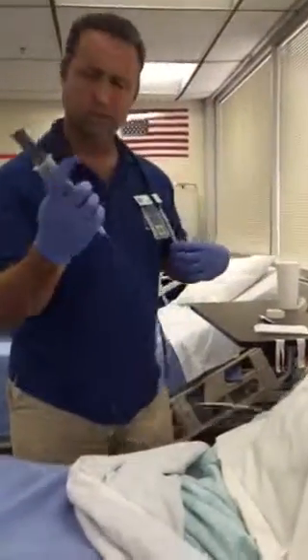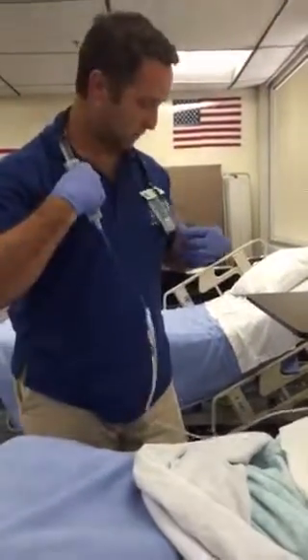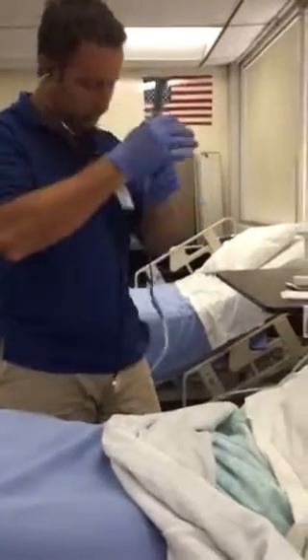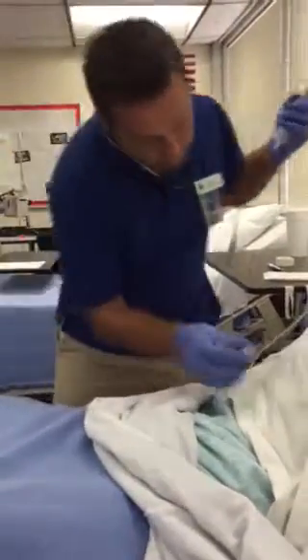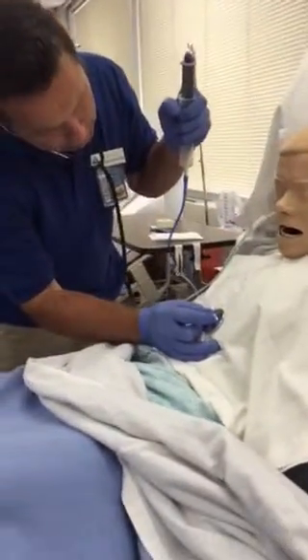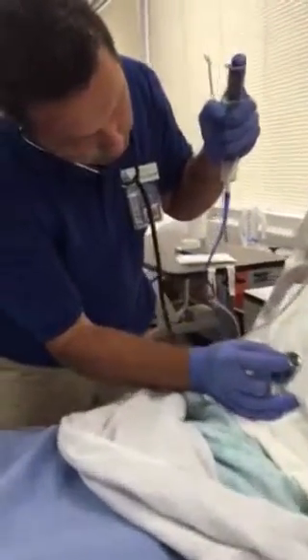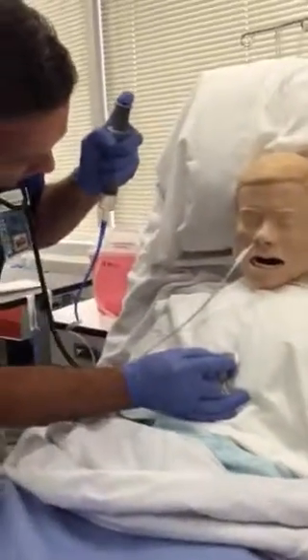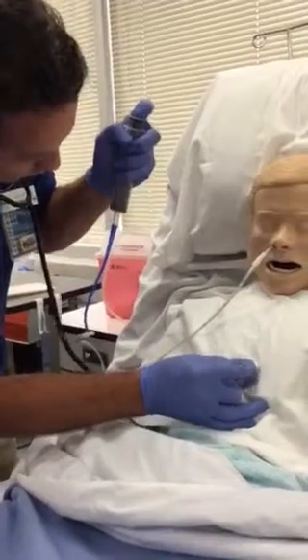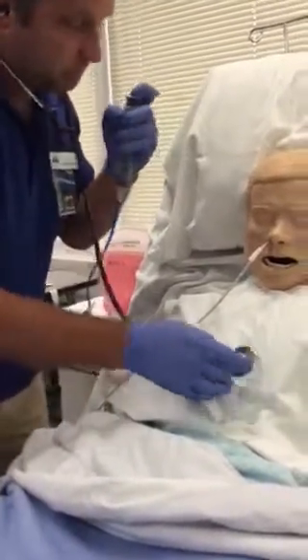So at this point, as I reinstill my stomach contents, I want to listen at the gastric area. Okay, so here we go. We're going to reintroduce the contents, and we're listening. I don't hear anything, and we're listening. And there you go. We have a little swirl, a little swish. And if we'd inject the air, we'd hear some gurgling. Very good.